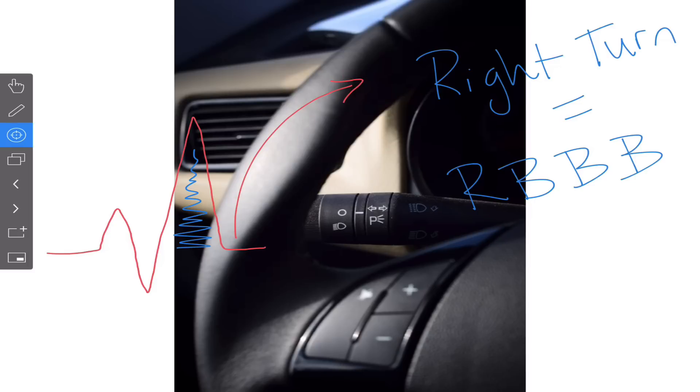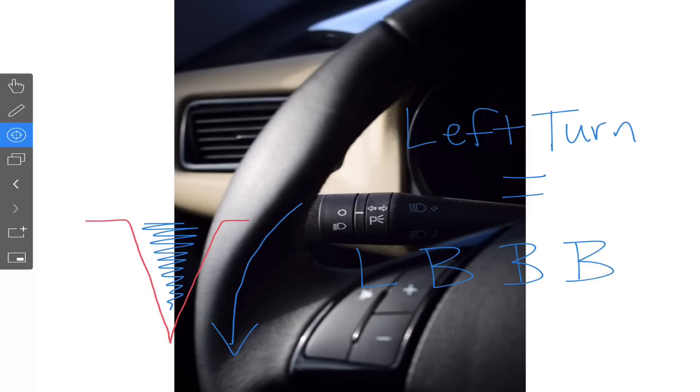If we're moving up, up and to the right, that's a right turn or a right bundle branch block. And the opposite is true. If we take this and we go down with our turning signal or down before the J point, we have a left turn or a left bundle branch block.